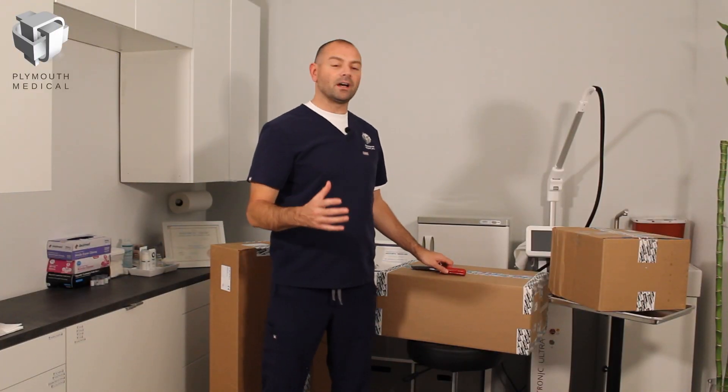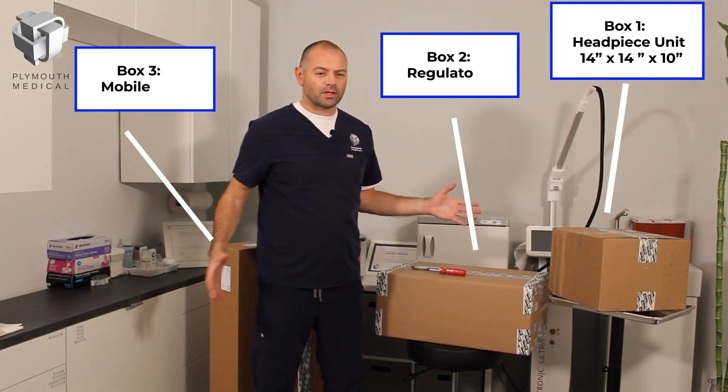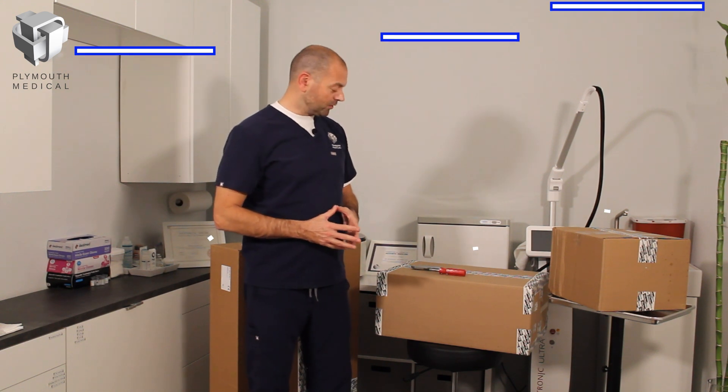We've got three boxes in our set. The smallest one contains the head unit, which we can ignore for the moment. The other two contain all of the components we'll need to construct the base, so we're going to start by taking a look at the middle box first.